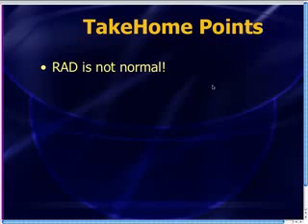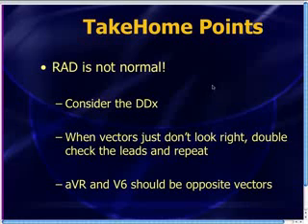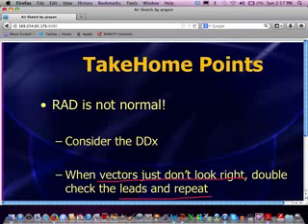So quick take-home points. Right axis deviation, RAD. RAD is not normal, especially in emergency medicine. Whenever you see right axis deviation, think about the differential diagnosis that we went through and pay special attention to lead misplacement when the vectors just don't look right. Especially when AVR and V6 are heading in the same direction, something's wrong. Check the leads and repeat the 12-lead EKG. You may be surprised at what you end up finding. You may end up treating a STEMI. Go figure. The STEMI resolved.